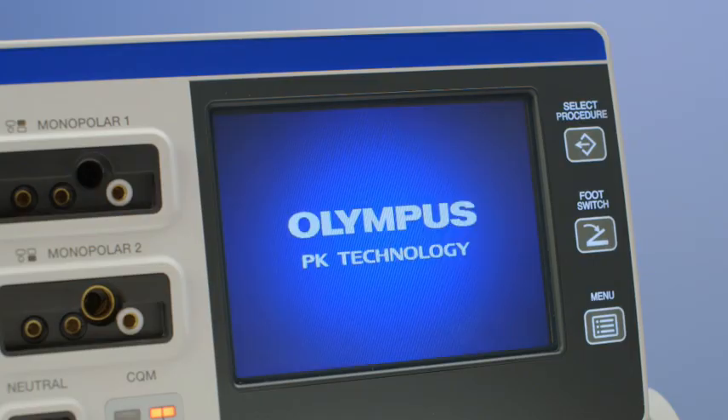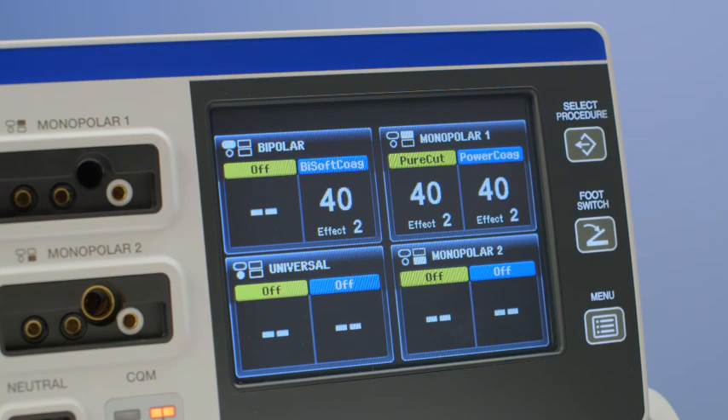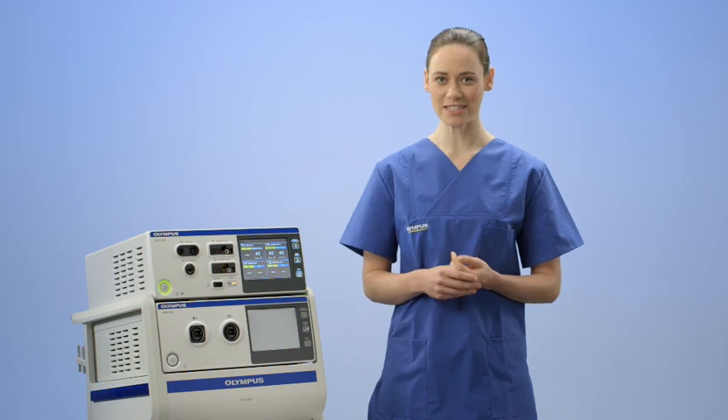You will see that it boots up quite quickly. This is helpful in situations where the generator is needed quickly, or if it is inadvertently switched off during a surgical procedure.